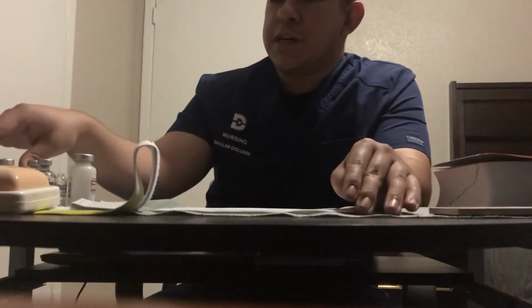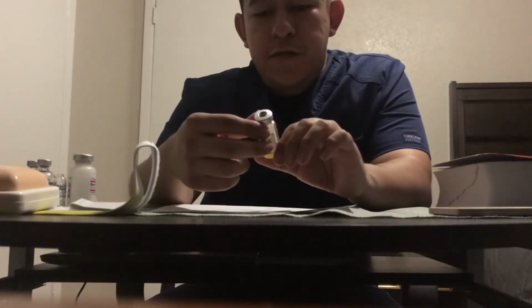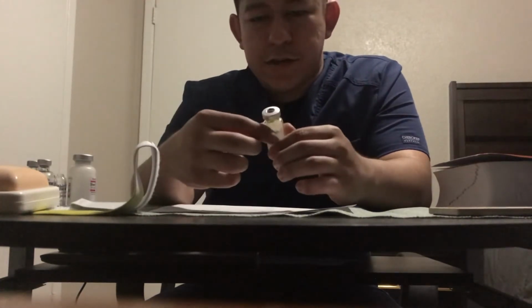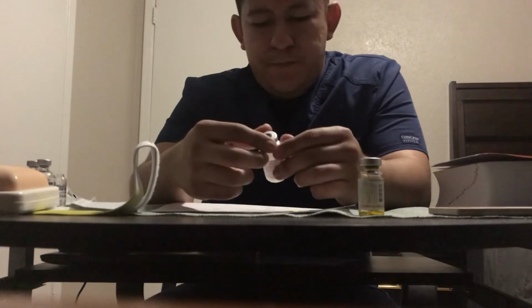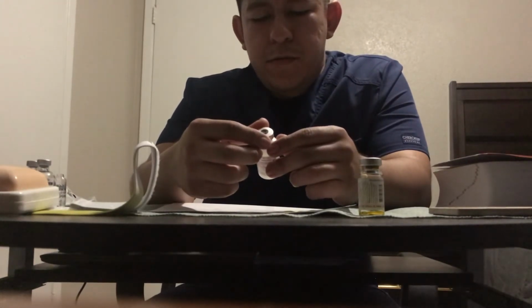So first medication check is for ceftriaxone 1 gram. Is this for Jack Buzzard? Yes, it is. Okay. Then we have our PPD. Okay. For Jack Buzzard.